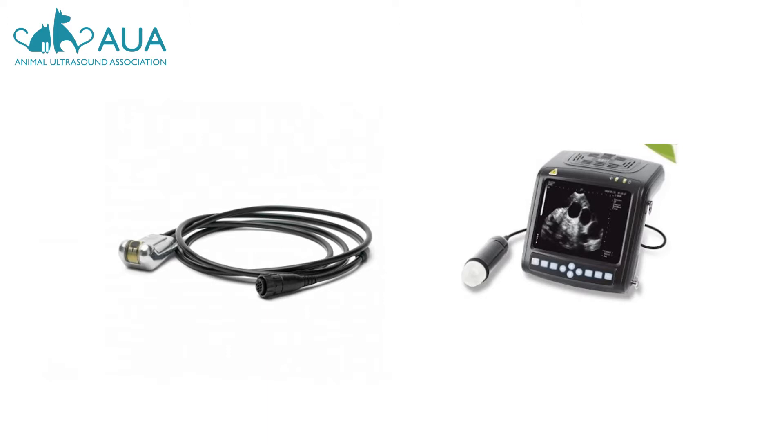This type of ultrasound technology is still available today, sometimes in an updated form such as the MSU seen on the right, and sometimes not. Regardless of the source, you should expect to pay no more than £1,500 for a machine equipped with a mechanical sector probe.